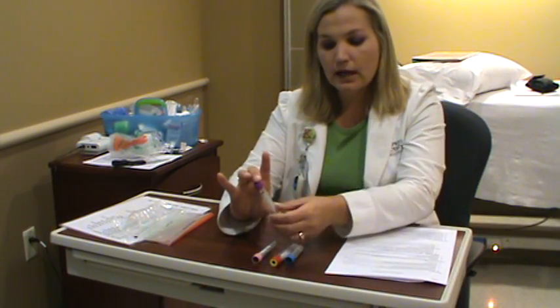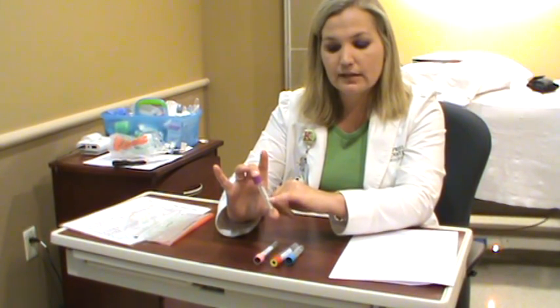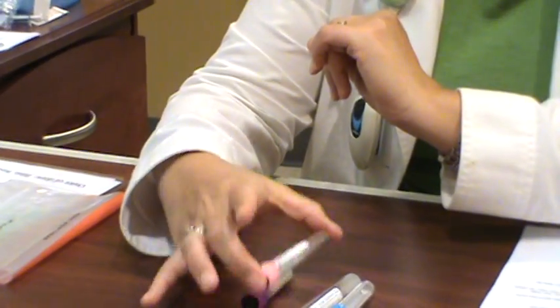The same goes for the purple top — there's a marking on it and they want you to fill it to that line, but if you can get it even half filled to that line, we can usually work with that. Same goes for the pink top: it has a mark it wants you to fill to, but if you get it halfway, we're good with that.